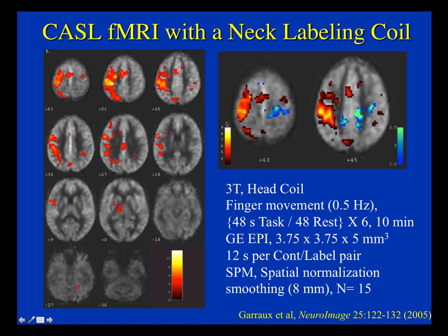And in this case, we were able to detect changes in blood flow in the contralateral hemisphere, that is actually reductions in blood flow rather than increases in blood flow. So these functional images are sensitive to changes in blood flow rather than BOLD. And one of the advantages here is that if you do functional MRI based on perfusion, or using ASL, you can quantify the change in blood flow due to a task.